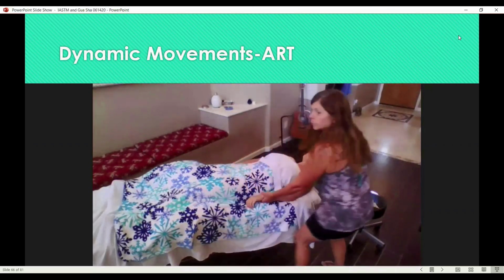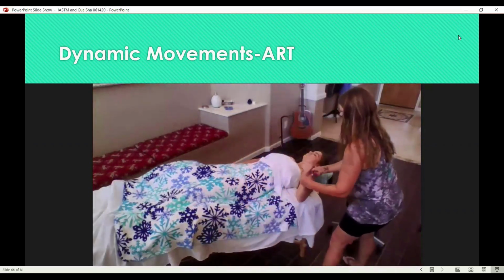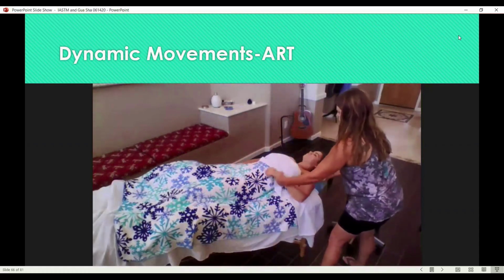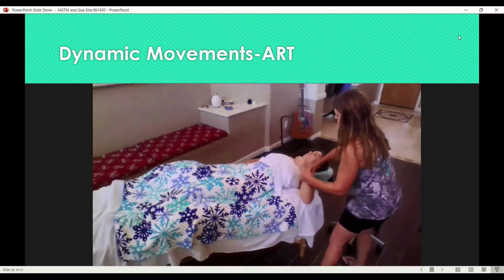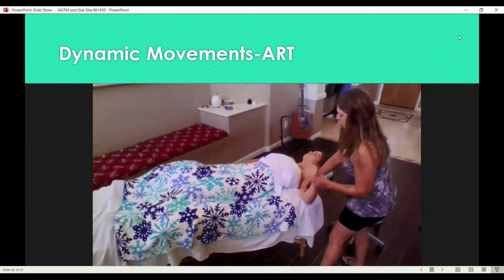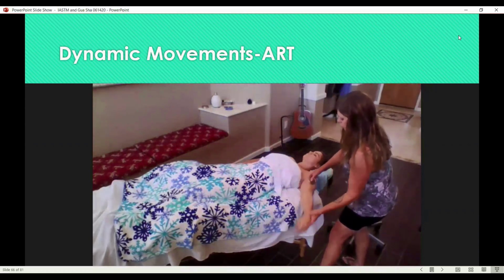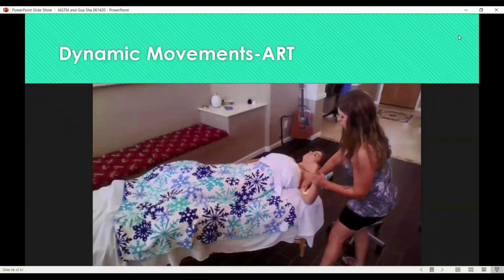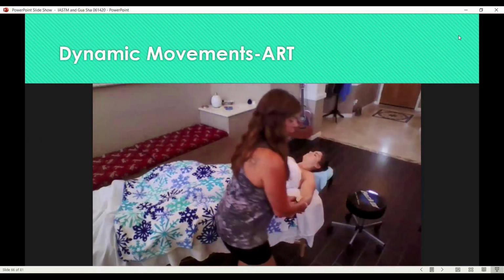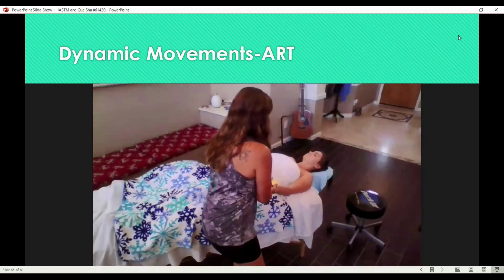I think this might be a continuation of what I was doing before. They're just in all different random orders here. All right, so we can do a little flexion, internal, external rotation, extension, moving the arm in every way it moves. And these are just sweeping strokes as I'm doing them, but you could do that with brushing as well.